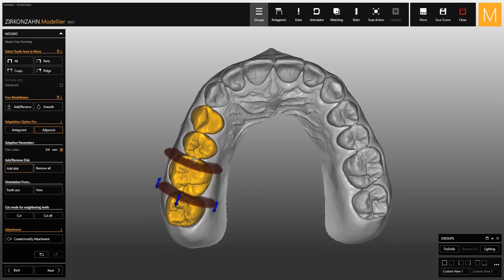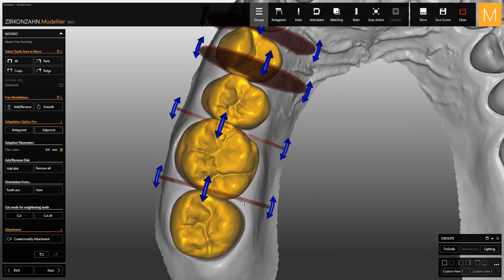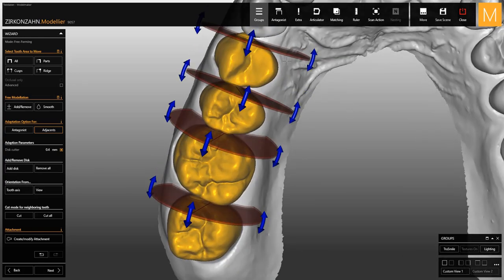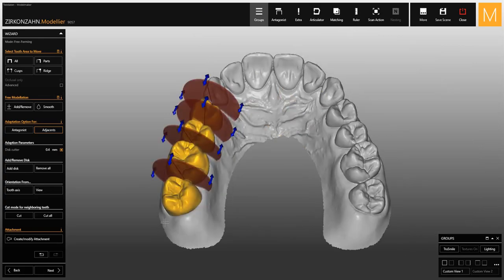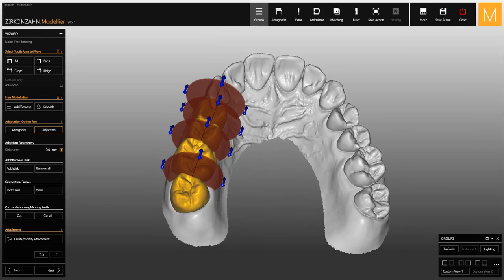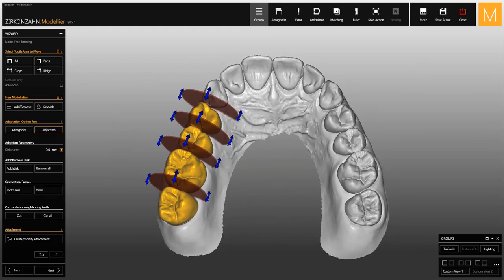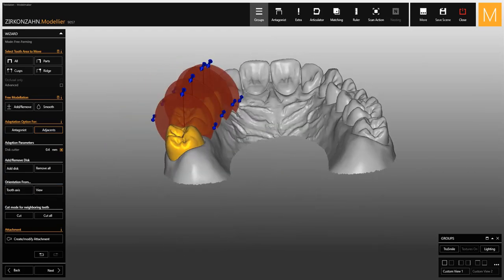You can then proceed to place them manually. There are arrows to rotate them, and if you want to move them you just have to click on the corresponding surface. The orientation of the disks can be based on the insertion axis of the tooth or on the view from which you are looking at the model.